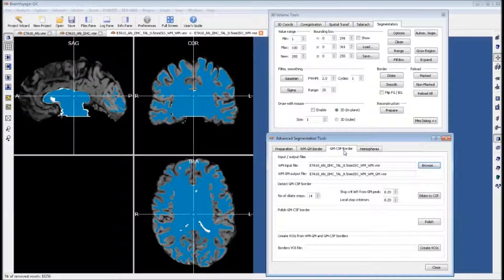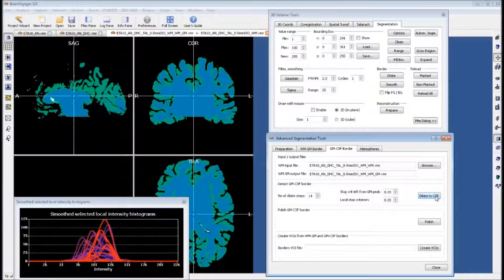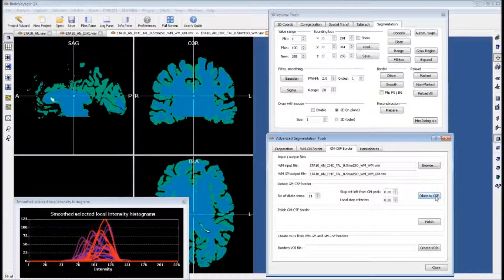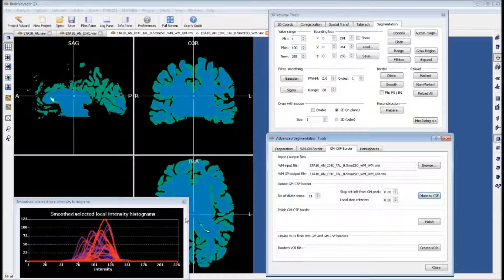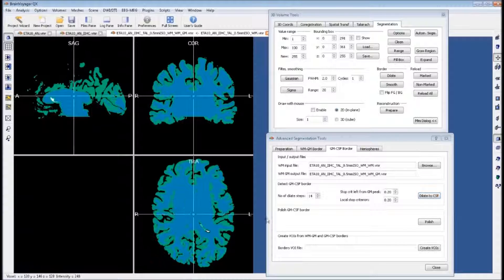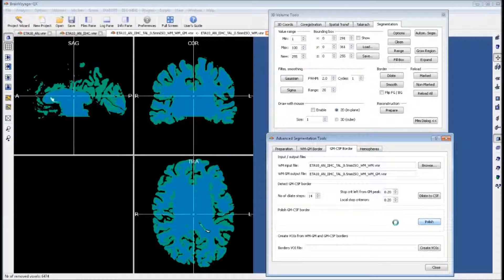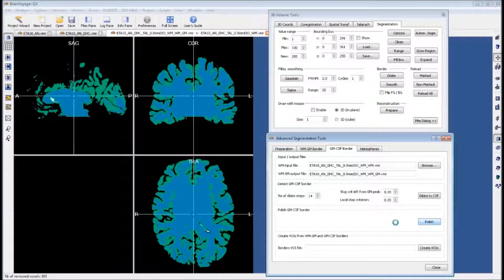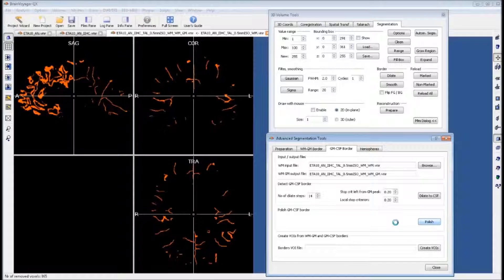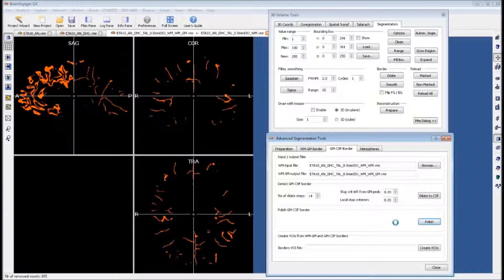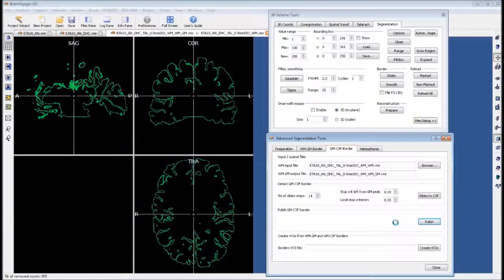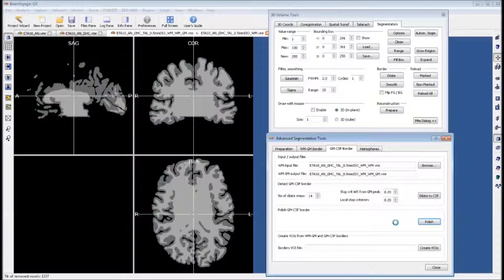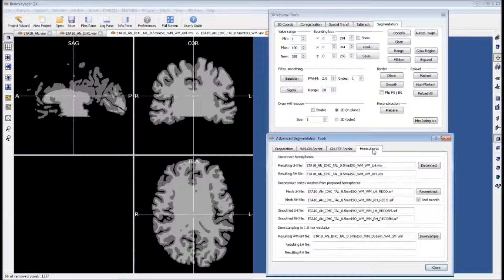Now we can go into the next tab in our segmentation tools. The next button we want to click is dilate to CSF, which marks the gray matter with the green coloring. Now we want to enclose the histogram window. Now we want to polish this, and what it creates is this brain in grayscale, the two gray colors.